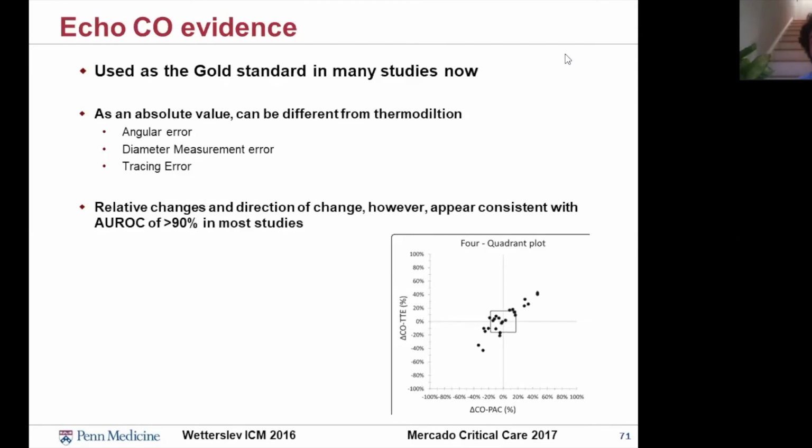Because as soon as they have enough volume, some of it will back up into the lungs. And I say that with the understanding that no test is 100% perfect. But at least in my experience and in the literature, the presence of A lines really strongly argues against a truly cardiogenic cause for the patient, unless the patient is also under-resuscitated. We know that our patients with impaired ejection fraction often do not get enough fluid when they have septic shock, or some other form of shock. But a resuscitated patient who has A lines, it's hard for me to believe that they have cardiogenic shock.